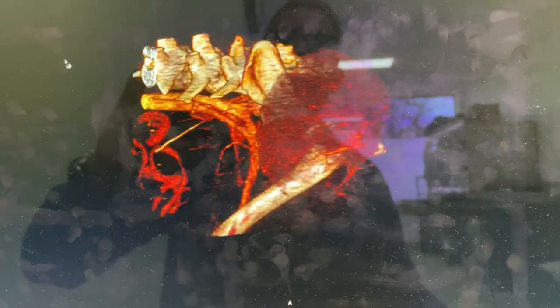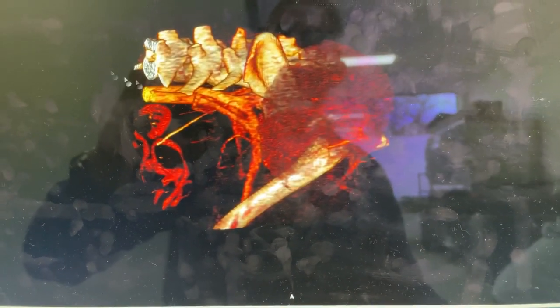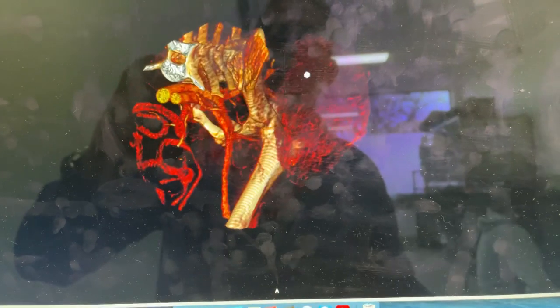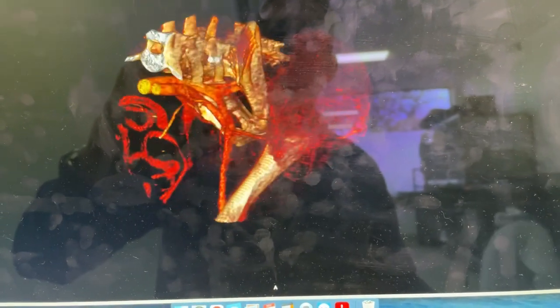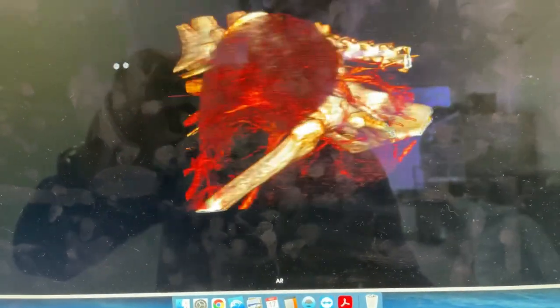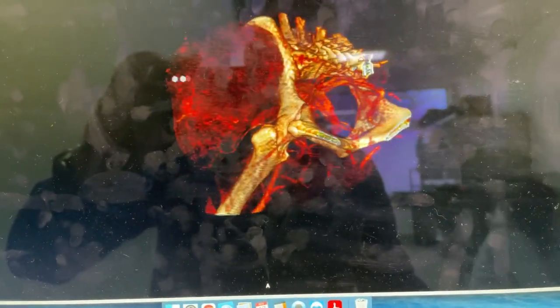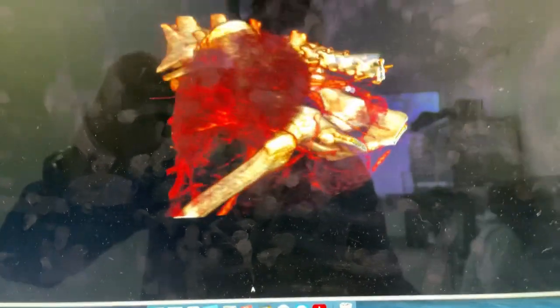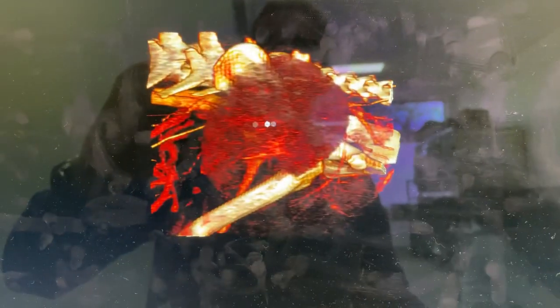So you can see here the mass sitting right over the pelvis on the lateral aspect right there. I'll turn down the brightness a little bit so you can see the underlying ilial wing. You can see the blood vessels that are fairly well developed associated with this mass.